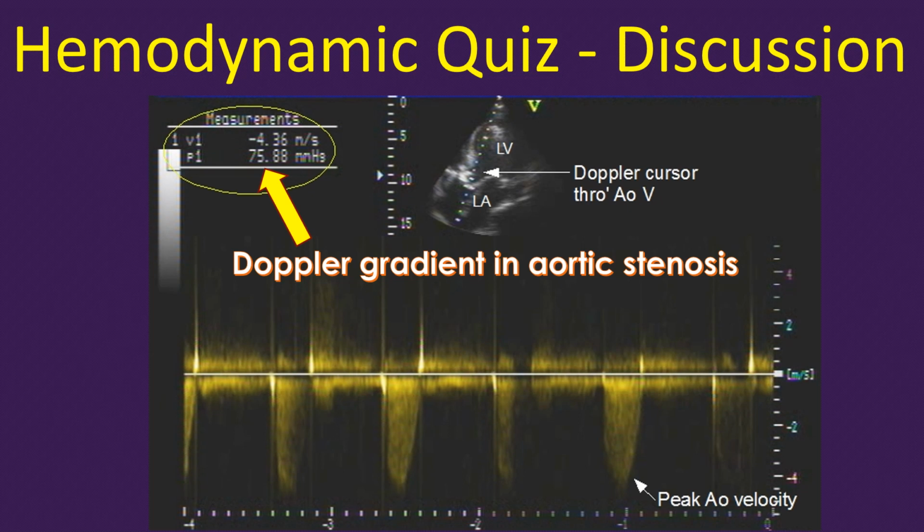Carabello effect is due to the enhanced obstruction across the aortic valve when the catheter is in the left ventricle in critical aortic stenosis. This can be observed as a rise in the aortic pressure when the catheter is pulled back from the left ventricle.